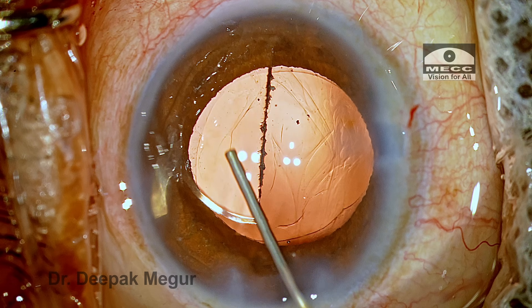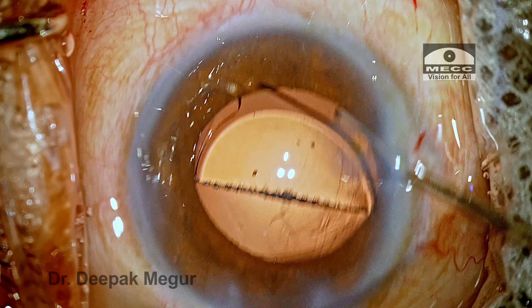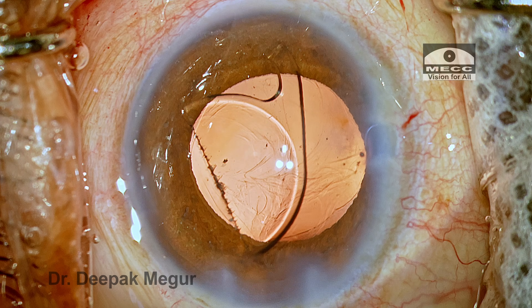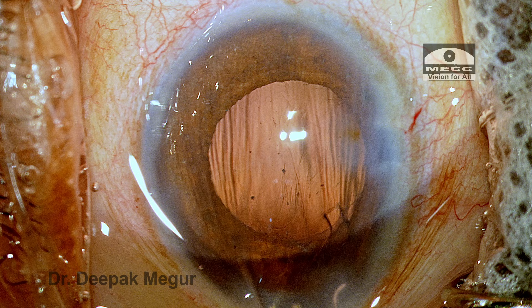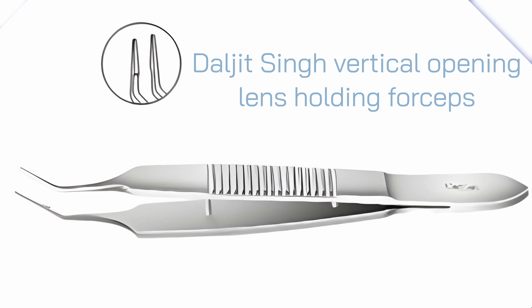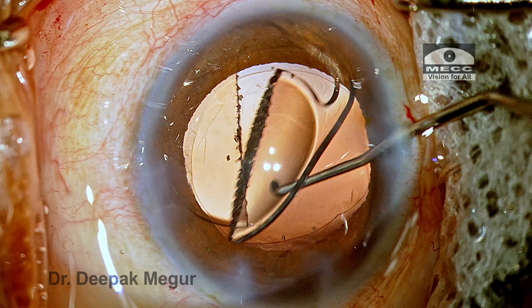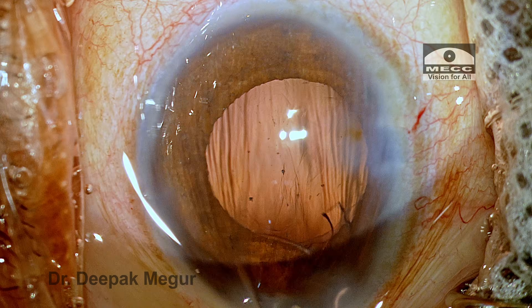Looking at the remaining second half, the orientation is not preferable. So I go in and rotate the haptic so that it comes to the right side with its convexity facing right. The lens is then held with the forceps and pulled out effortlessly. This is a 6mm lens that has come out in two pieces through a 2.8mm incision. The forceps used is the vertically opening Daljit Singh forceps — you can also use McPherson forceps, but I prefer this one. Following these strategies, one can explant an IOL in a stress-free manner without collateral damage to the cornea or capsular bag.